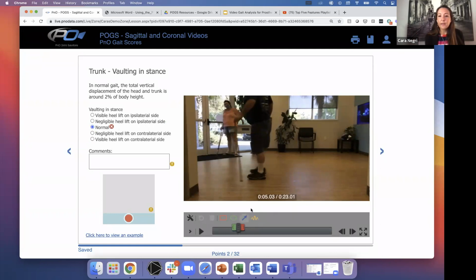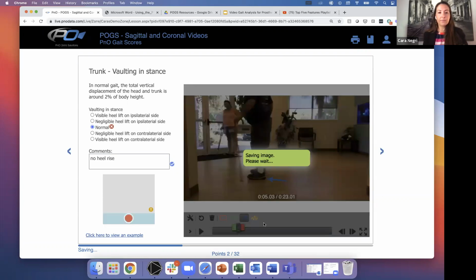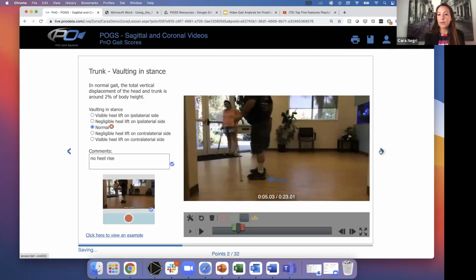I'll go back to this screenshot here. And again, something just very simple. I can just point and say no heel rise. And we'll just take a screenshot. All right.